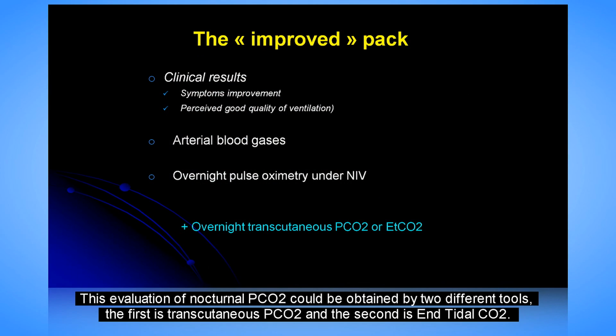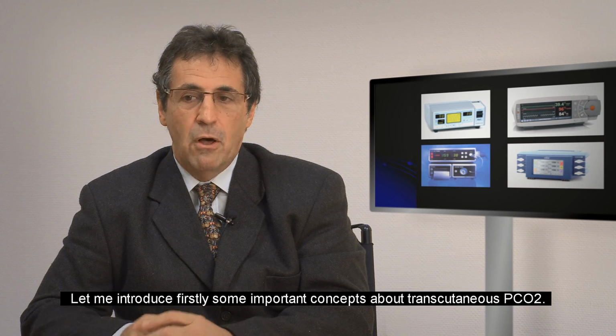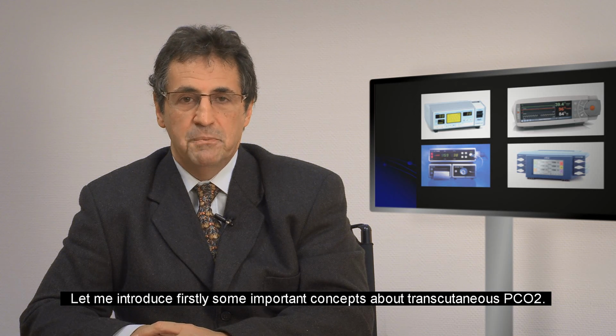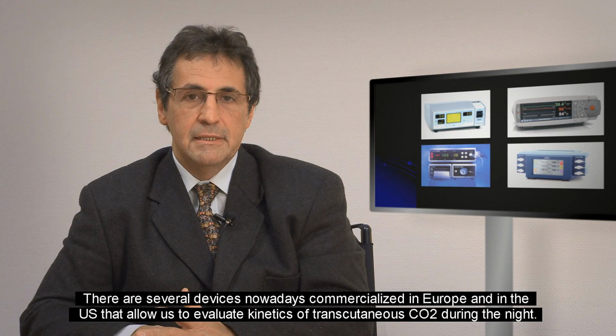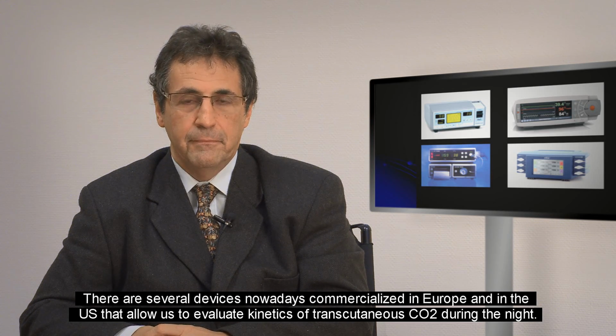This evaluation of nocturnal PCO2 could be obtained by two different tools. The first is transcutaneous PCO2, and the second is end-tidal CO2. Let me introduce firstly some important concepts about transcutaneous PCO2. There are several devices nowadays commercialized in Europe and United States that allow us to evaluate kinetics of transcutaneous CO2 during the night.